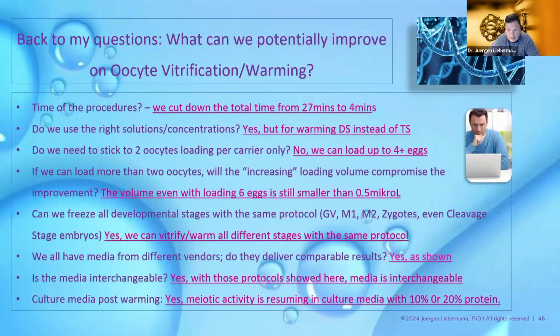So to come to my summary and ask my questions, time of procedure: he can cut down the total time from 27 minutes to 4. When I say 27 minutes, we vitrified in 16, and when we thawed in 11, now it's 2 and 2. Do we use the right solution and concentrations? Yes, but for warming, I use 0.5 molar instead of TS.